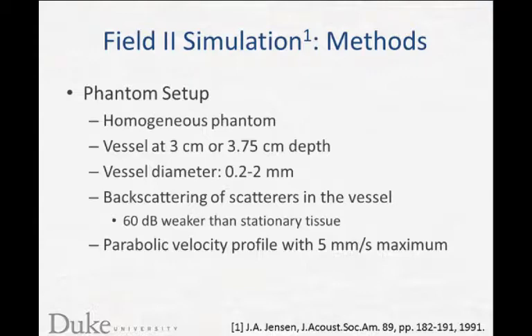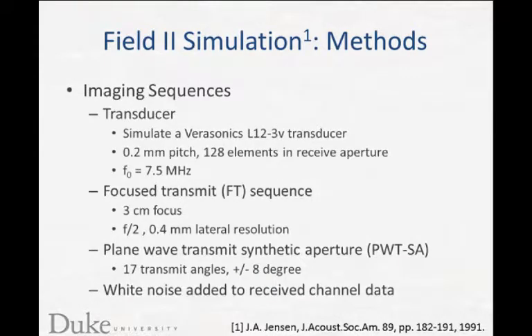Then we will use imaging sequences to image a cross-section of the vessel. Those sequences simulate a transducer that will be later used in our experimental studies, which is Verasonics' L12-3V transducer with 0.2 millimeter pitch and 128 elements. The center frequency is 7.5 megahertz. Two sequences will be used in the simulation. One is the focused transmit sequence with 3 centimeter focus and f/2 setting. The second one is plane wave transmit synthetic aperture sequence with 17 transmit angles covering plus minus 8 degrees. White noise will be added to the received data to simulate thermal noise.